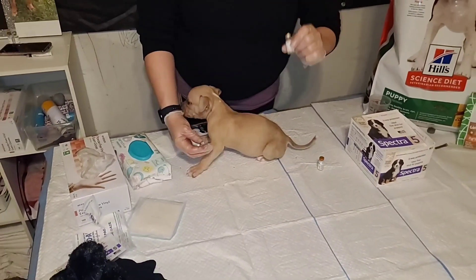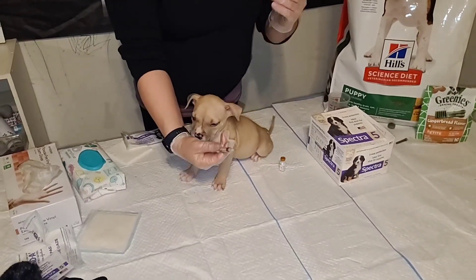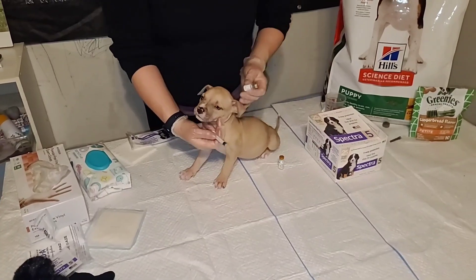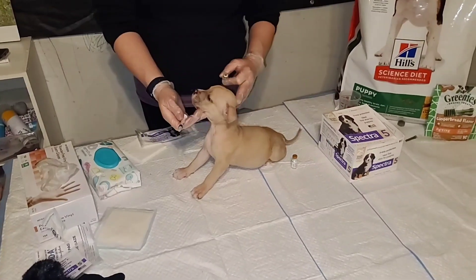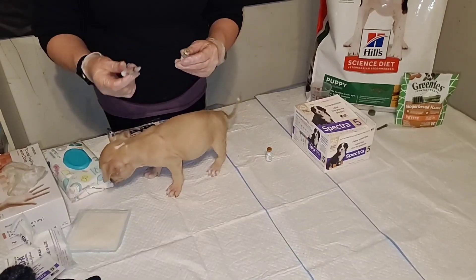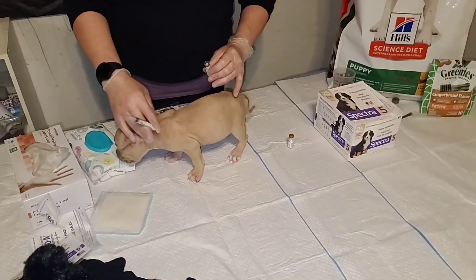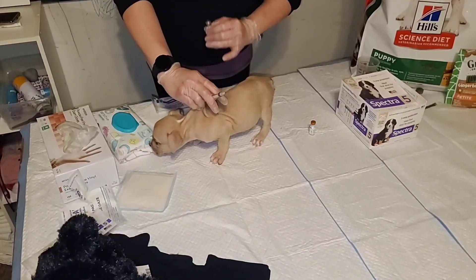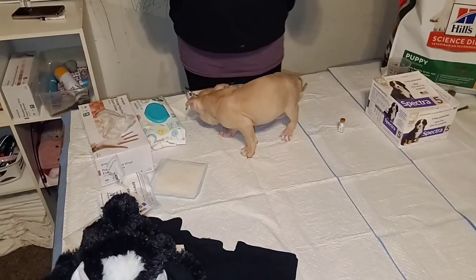You're not going to use alcohol or anything like that. Antiseptic is not recommended for dogs — it can interfere with the vaccines. So you just pick your site and inject. There are different sites you can choose from. You're going into the skin; it's not going into the muscle — it's a subcutaneous injection.